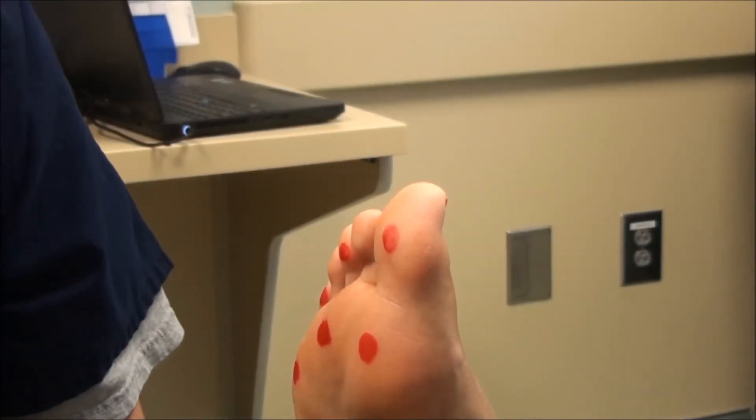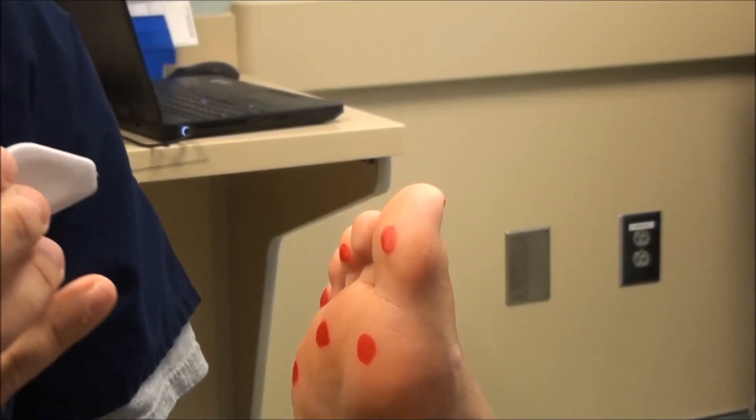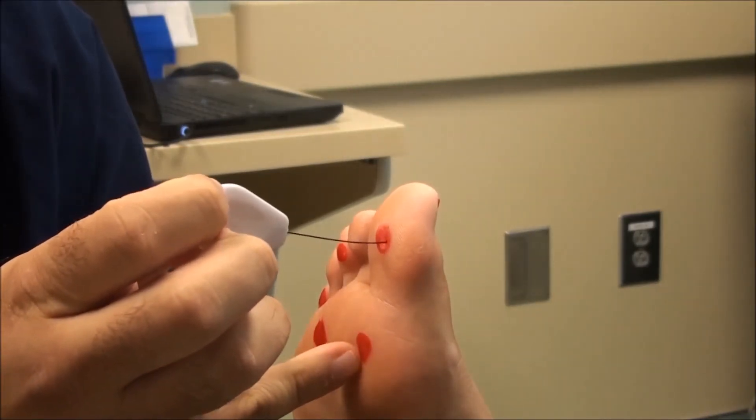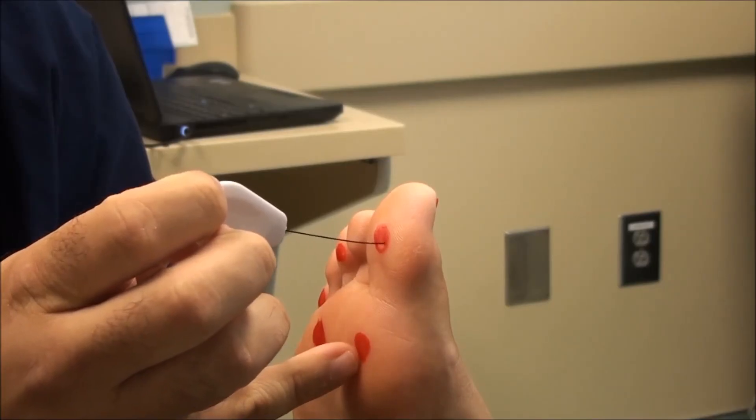It's very important to apply even and equal pressure to the monofilament when it's in contact with the foot. Ideally you want to just push until you see the monofilament bending — that's all the pressure that you need.